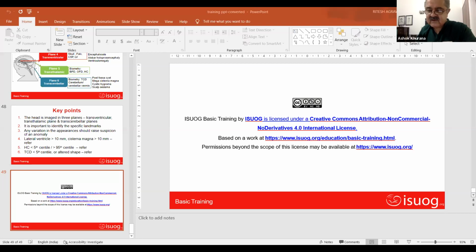The first thing that Dr. Hasmukh emphasized for us was that we must be able to identify that this ultrasound scan is normal. If you've done that, that is fantastic. And if it is abnormal, then it needs a referral onto an appropriate center where this can be evaluated. So remember that we will continue to work with basic planes, basic protocols, basic measurements, and say, okay, normal. If we find any variation, then we need to refer to a center where this can be handled. And therefore, we will be able to then see things very, very nicely.